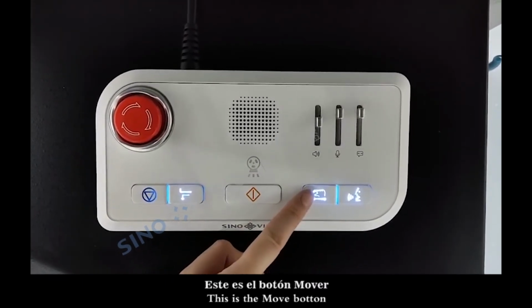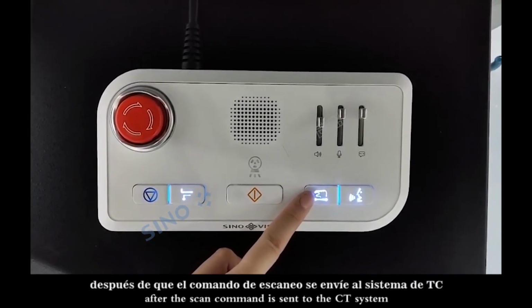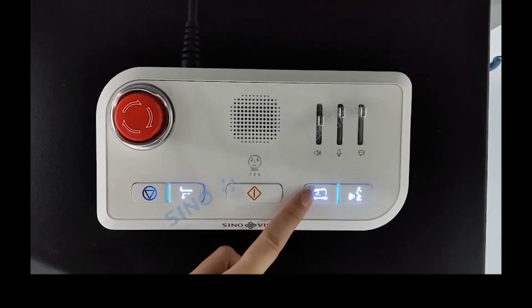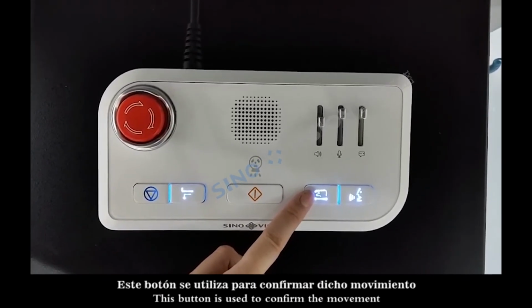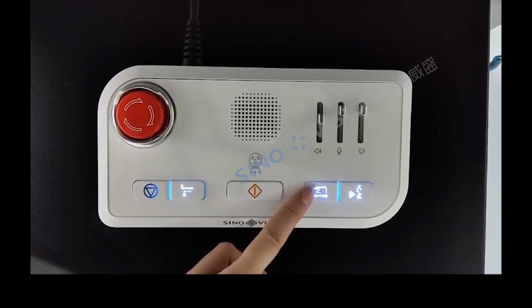This is the move button. After the scan command is sent to the CT system, the patient table needs to be moved to the start scan position. This button is used to confirm the movement.